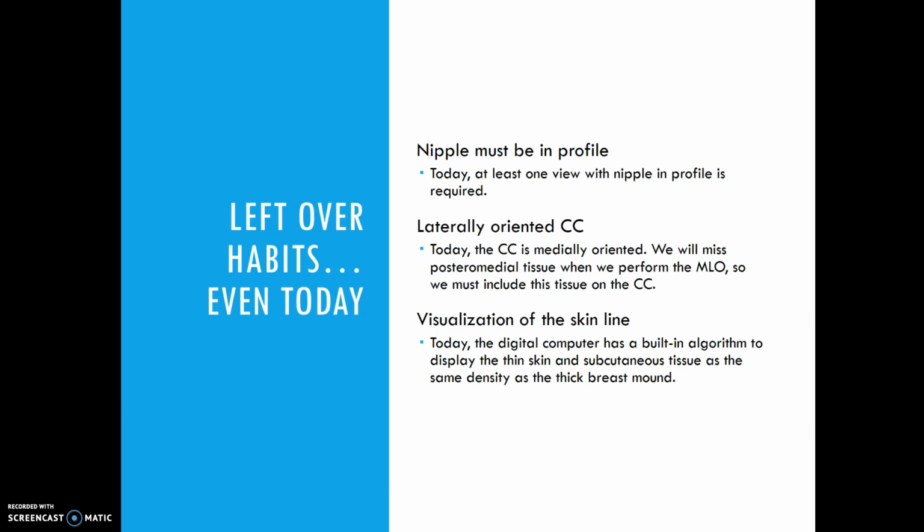So as long as the nipple is in profile in one of the views, then you can sacrifice that in the second view.